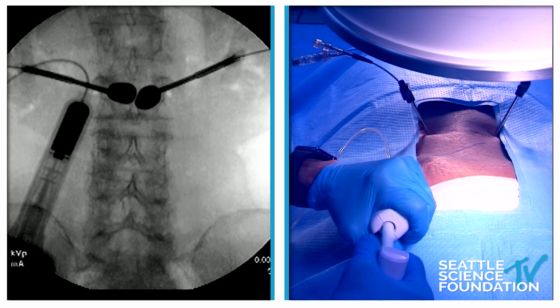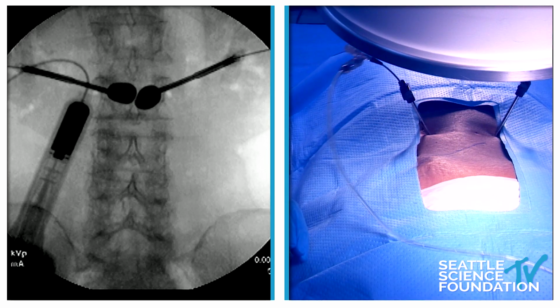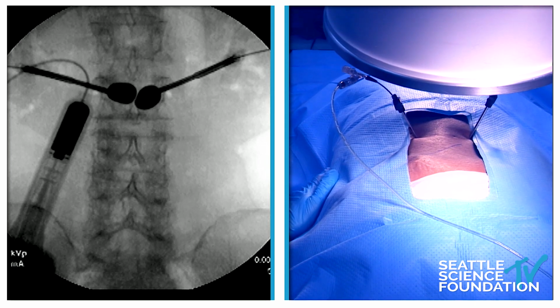I'm going to deflate these by triggering. Hold on just a second, Doug. Let me point something out to the fellows: what you see with both of those balloons is the lateral aspect of each balloon goes beyond the medial border of the pedicle.